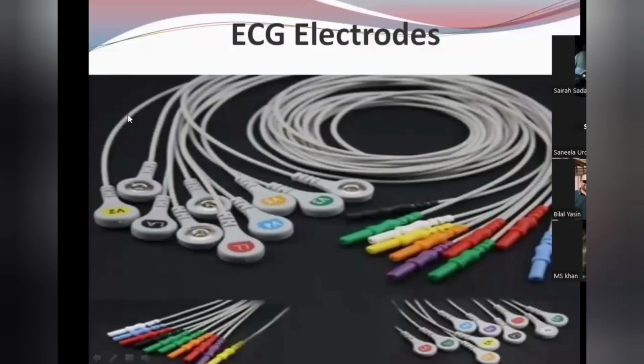All right. Some of you may call these leads, but these are not actually leads. These are actually ECG electrodes. All these have different shapes and different colors as per the company make. But we will go for the standard ones.